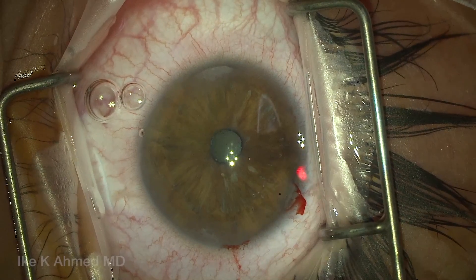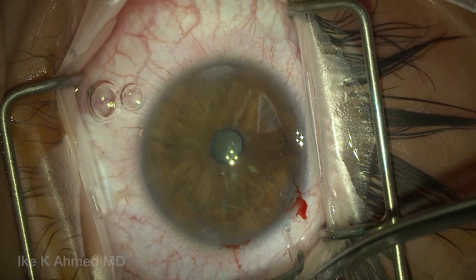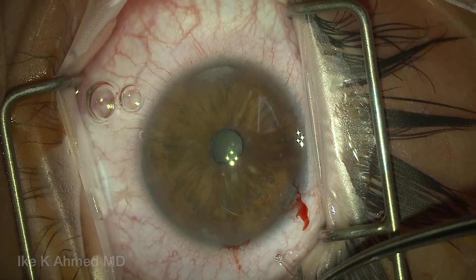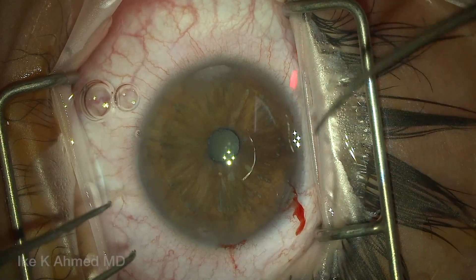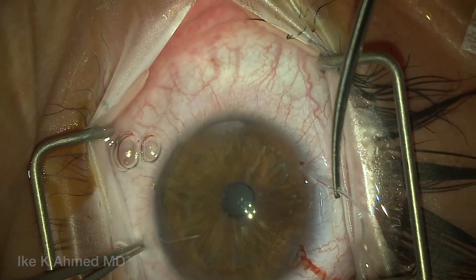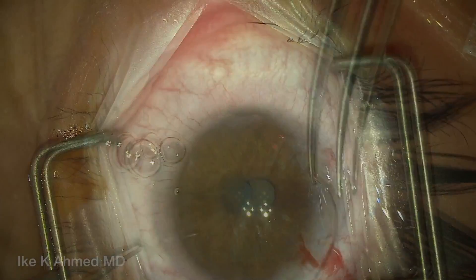This is a juvenile open-angle glaucoma patient in which we will perform ab internal canaloplasty as well as the GATT procedure, or the gonioscopic-assisted transluminal trabeculotomy.